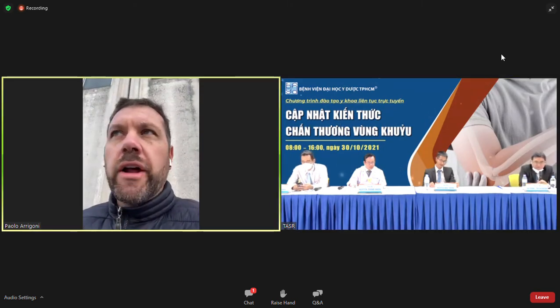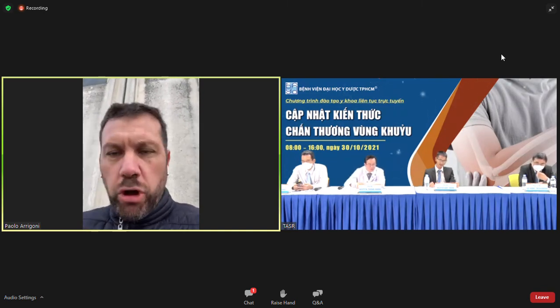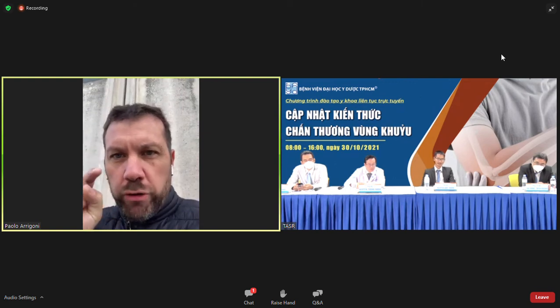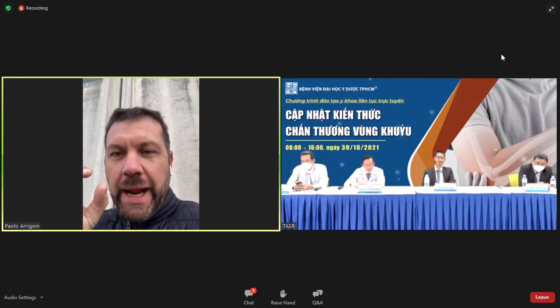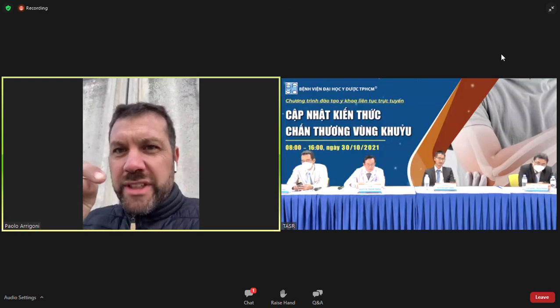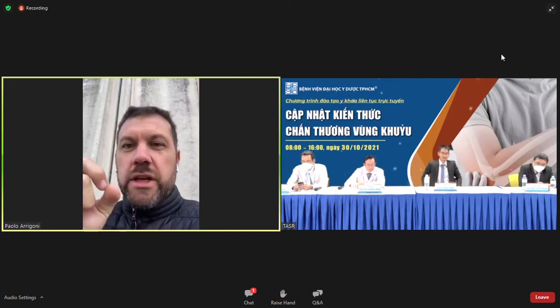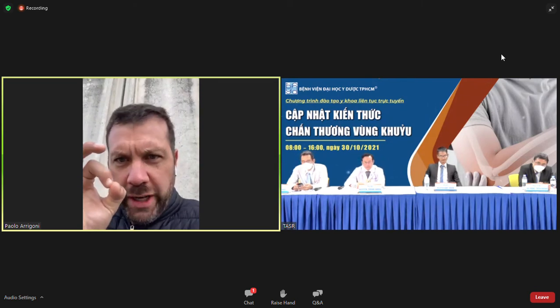Let's say that I completely do not have a radial head. It's completely gone, lost. At that point, I would start by measuring the diameter of the capitellum on the humerus. I know that diameter is probably going to match the diameter of the inner circle of the radial head, the circular component, not the sigmoid component. So I know that's my lowest possible measure of the implant.